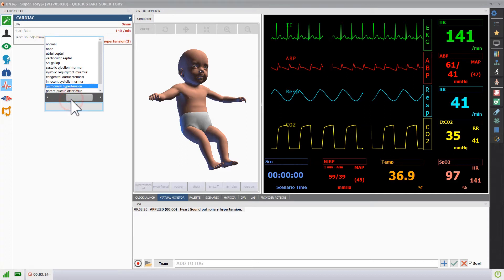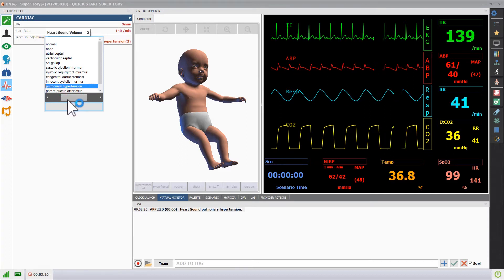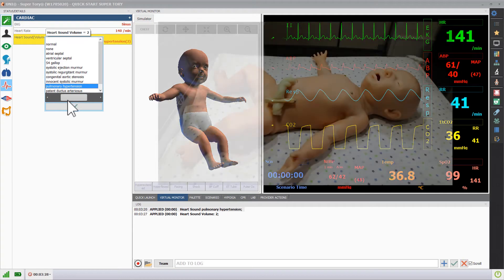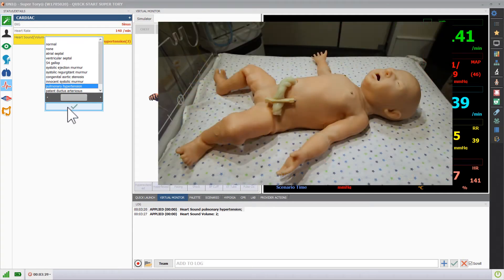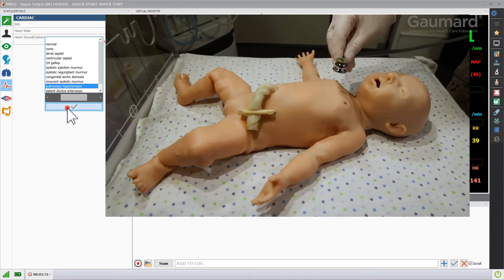You can adjust the volume by moving the slider to the left or to the right. SuperTory's heart sounds are synchronized to the ECG and heart rate.